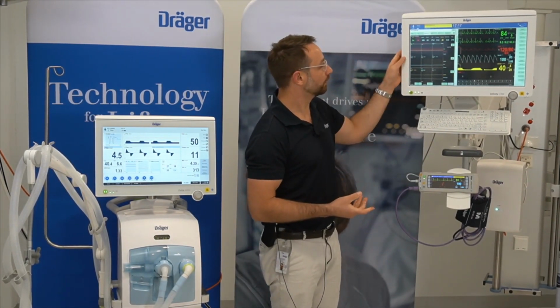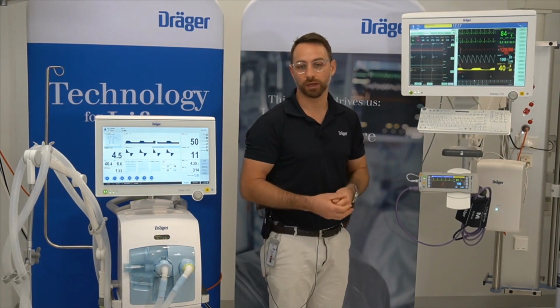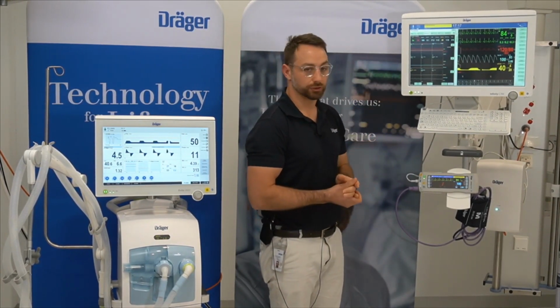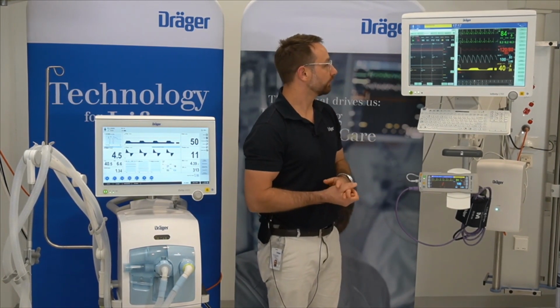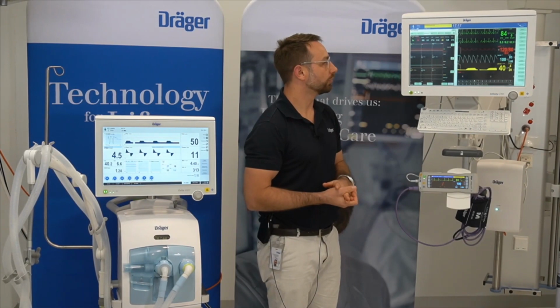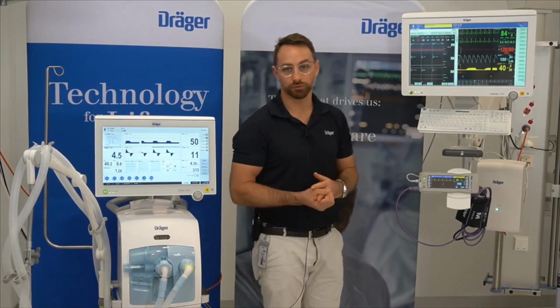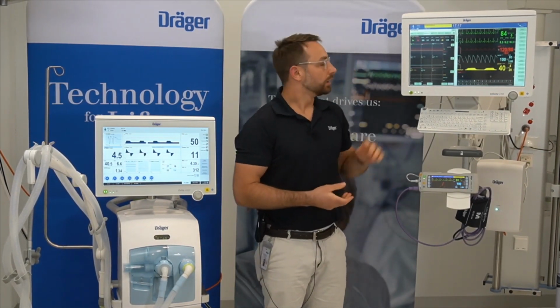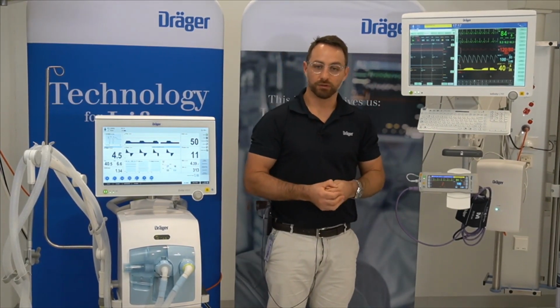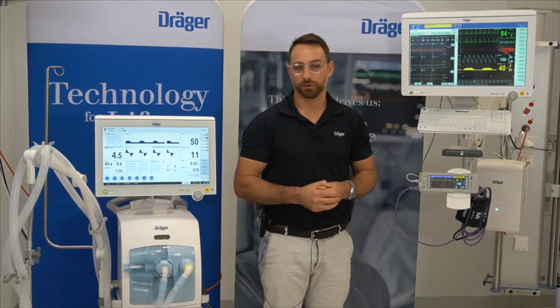For this example, I've got a recruitment trend that I've set up specifically for this scenario. I've got heart rate, mean arterial pressure, SpO2, PEEP, PIP, P-mean, end tidal CO2, dynamic compliance, and tidal volume expired. What this allows a clinician to do is see all the parameters in one place to see whether or not another parameter is being sacrificed.